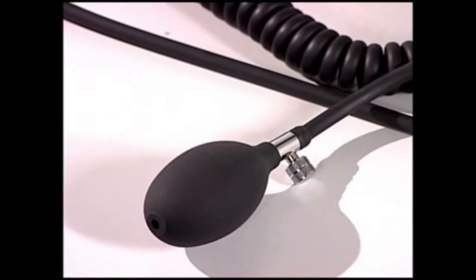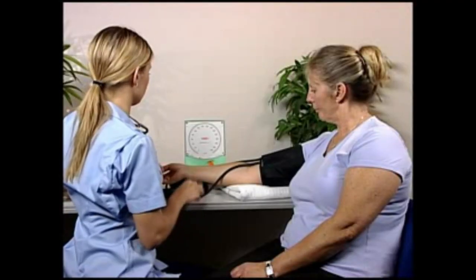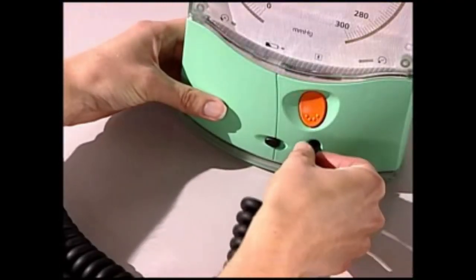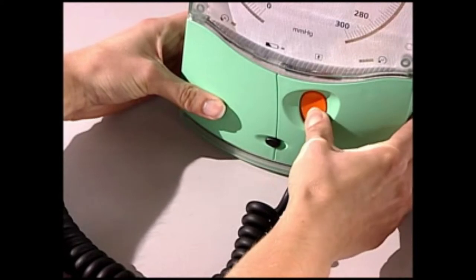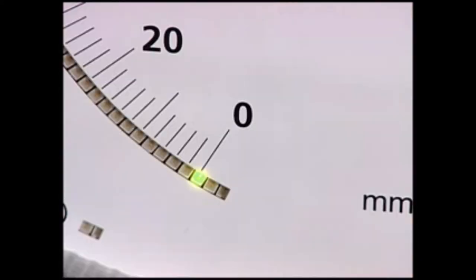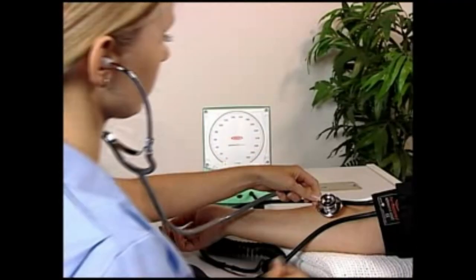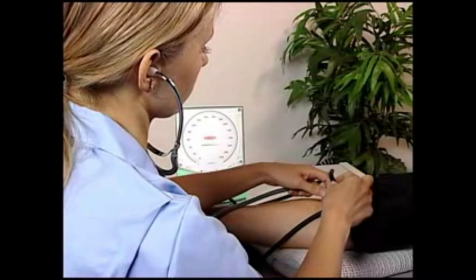Open the air control valve to ensure that there is no residual pressure in the cuff. Then connect the tubing to the GreenLight 300 and switch on the device by pressing the orange button. The GreenLight 300 will automatically self-calibrate and a pressure of zero will be displayed. This unique function ensures an accurate and reliable display of the cuff pressure.